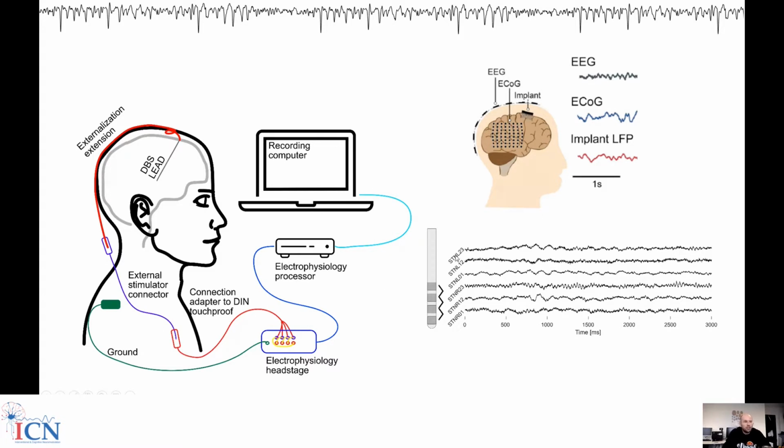Now, what you see here is exemplar real LFP activity that is already referenced as a bipolar montage between adjacent contacts. That means what we see here is really local activity. It is the difference of voltage that we record from this channel to this channel.